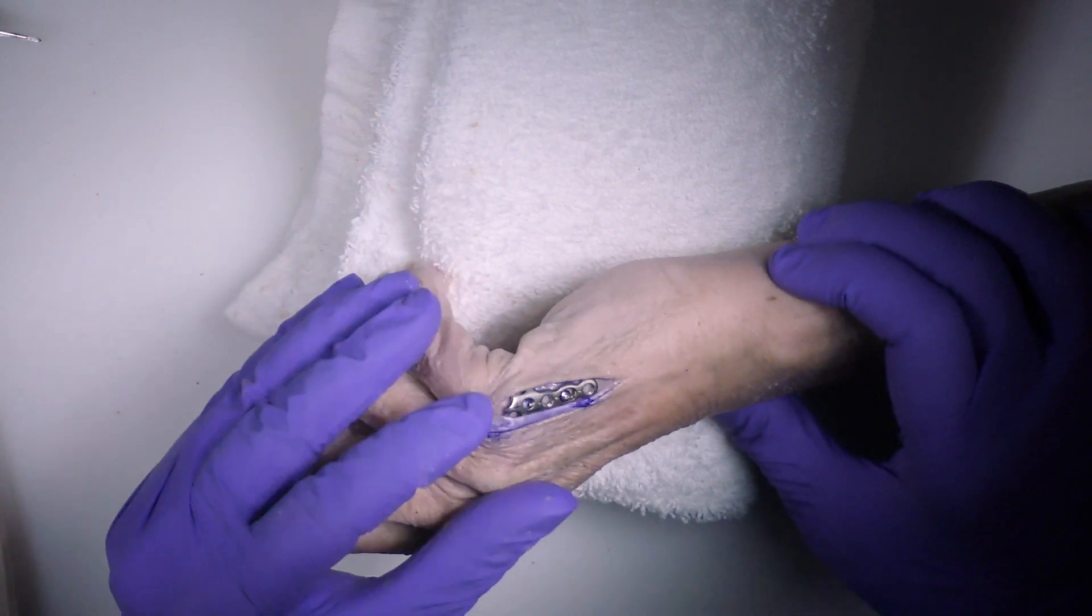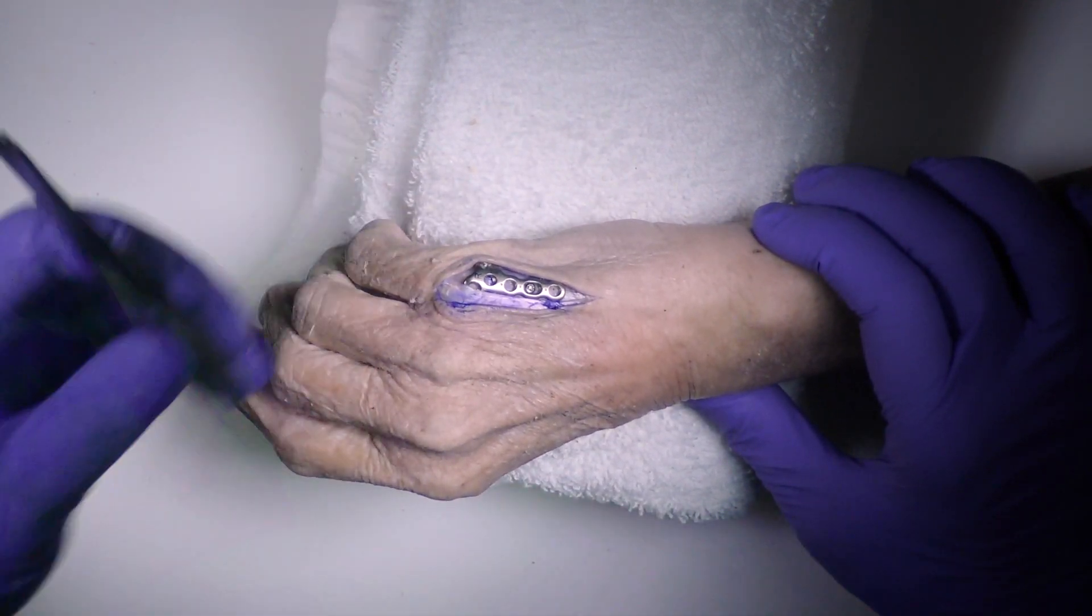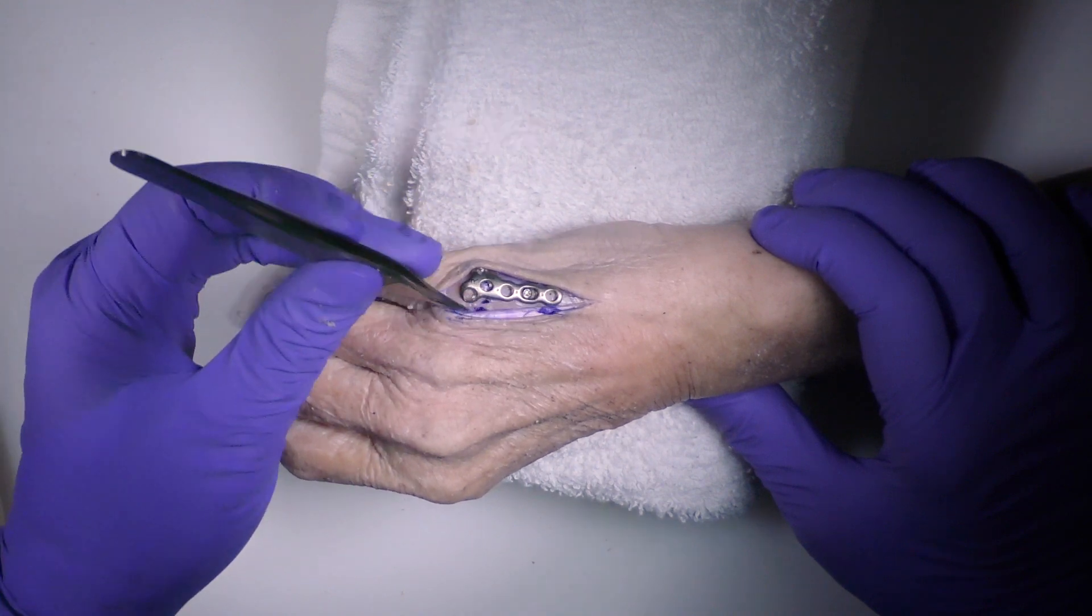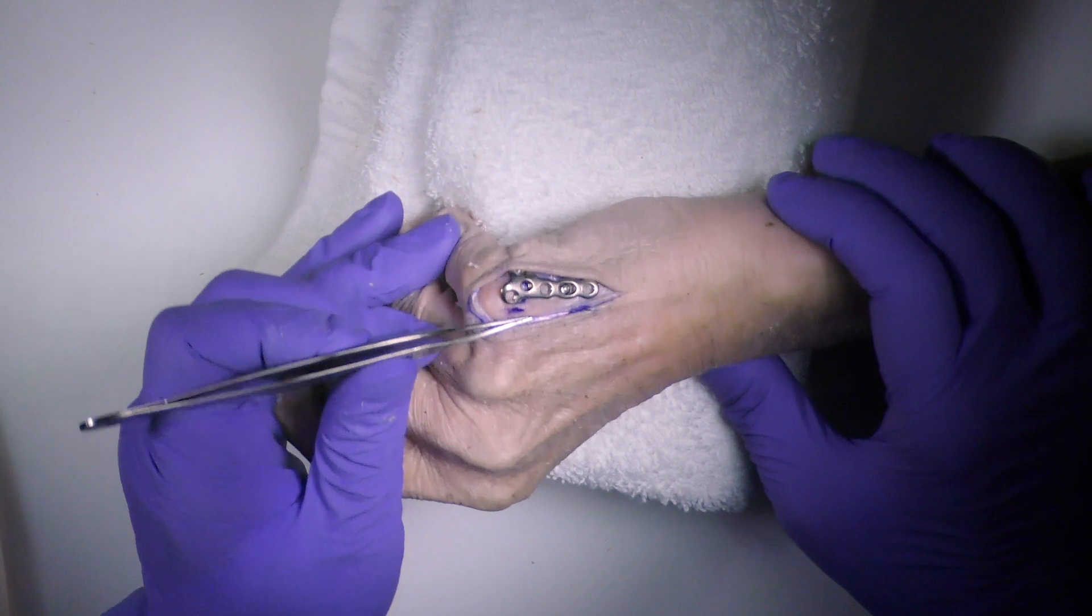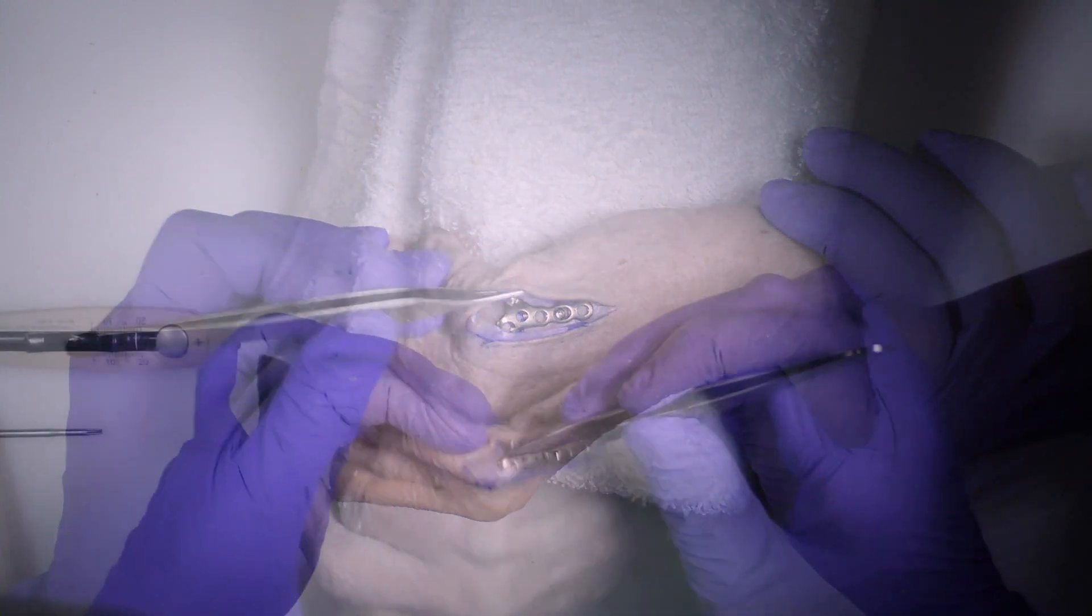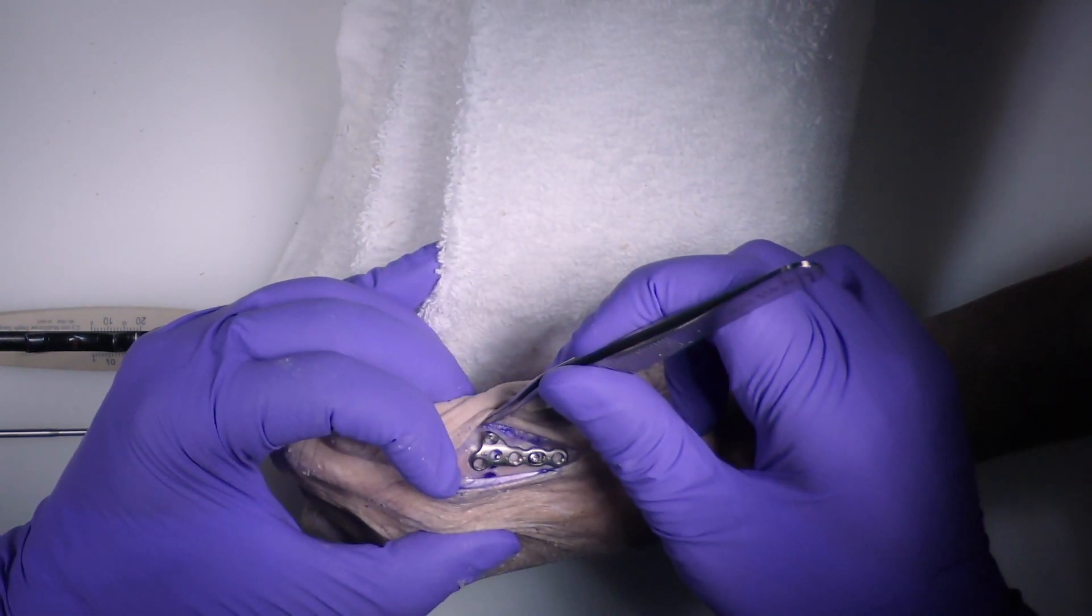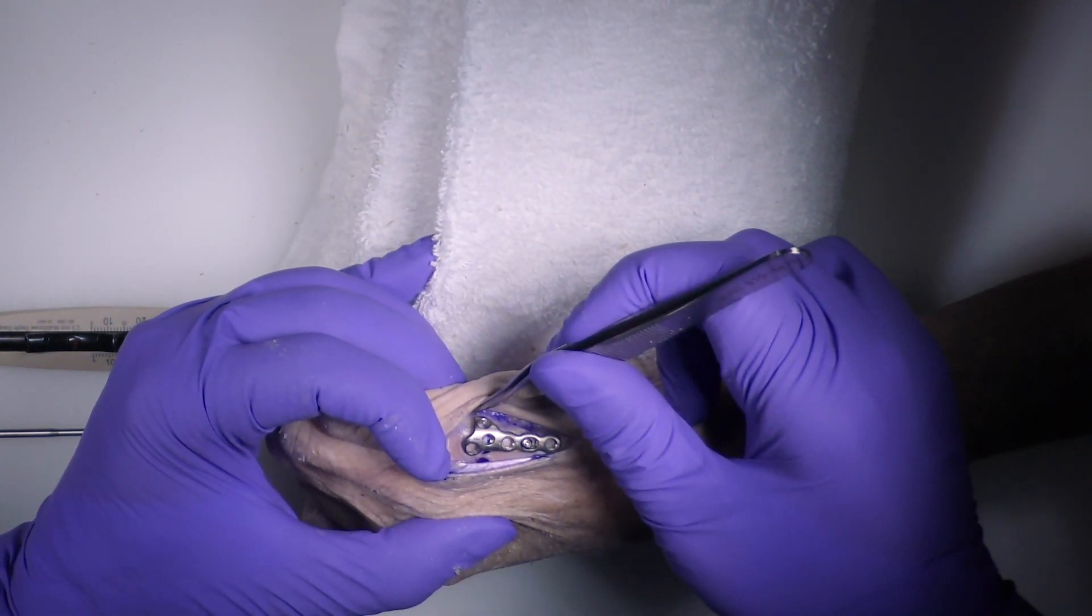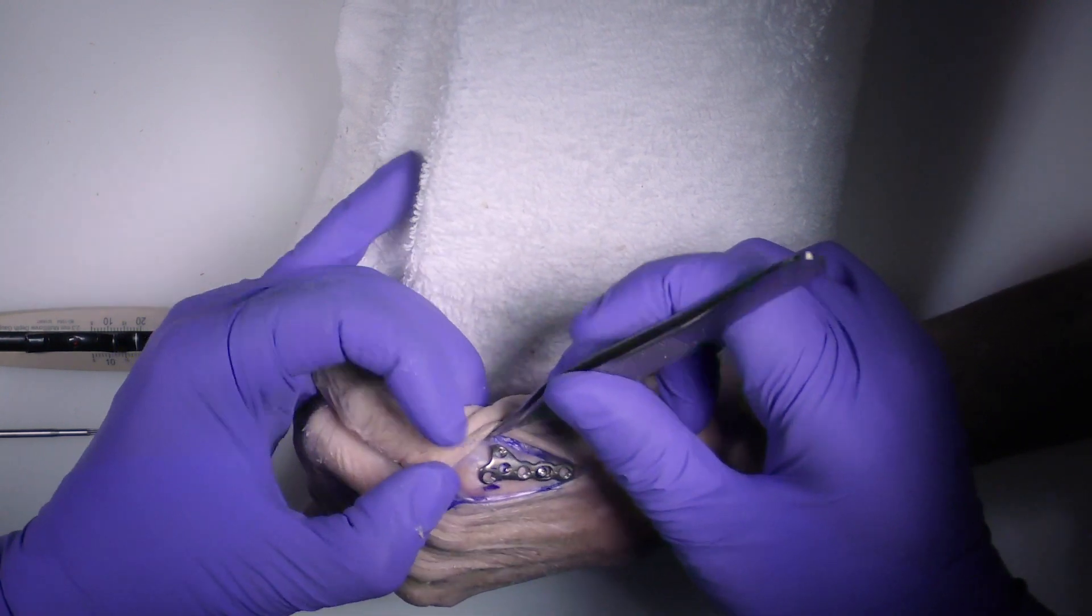And we can do a quick image just to make sure. I find flexing the head helpful to kind of see where it sits. You'll see it's not proud relative to the head. You'll see how it's sitting off axis a little bit, as it's designed to do. If you're happy with the reduction and you see that the piece is right exactly where you want it relative to the plate and what have you, then you can just go ahead and fill this all with locking screws.